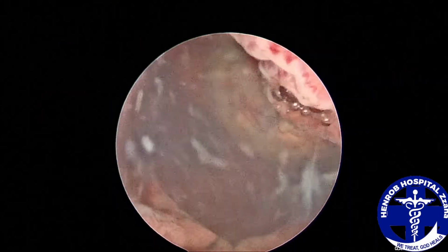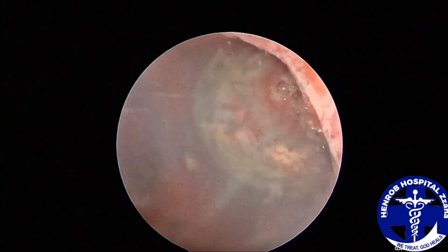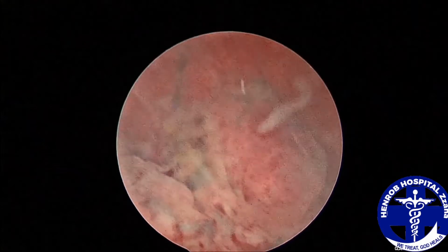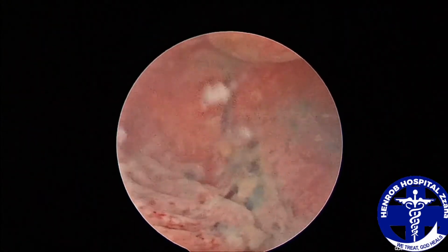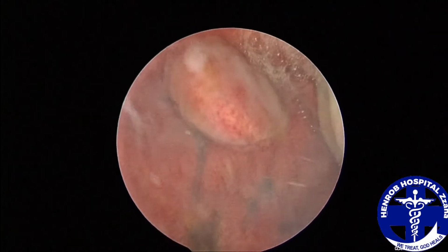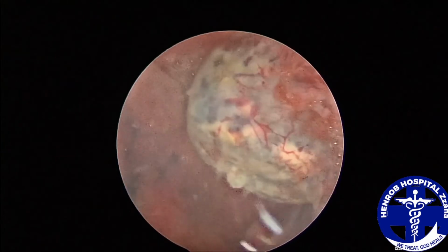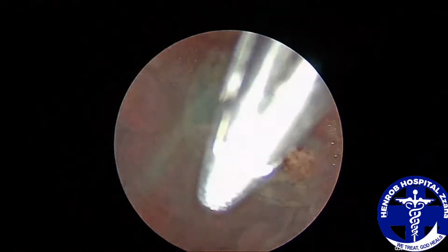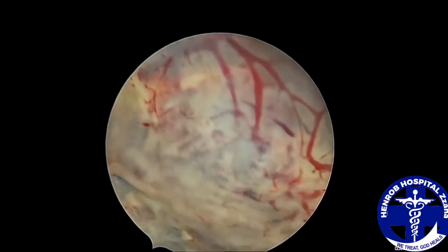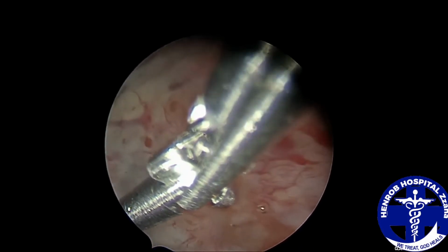We used the usual diagnostic scope with pressures of about 100 millimeters of mercury to distend the uterus. And of course, during pregnancy, you want to use low pressures to avoid extravasation. Then you can clearly visualize the gestational sac, and using a hysteroscopic grasper, you can puncture the sac.